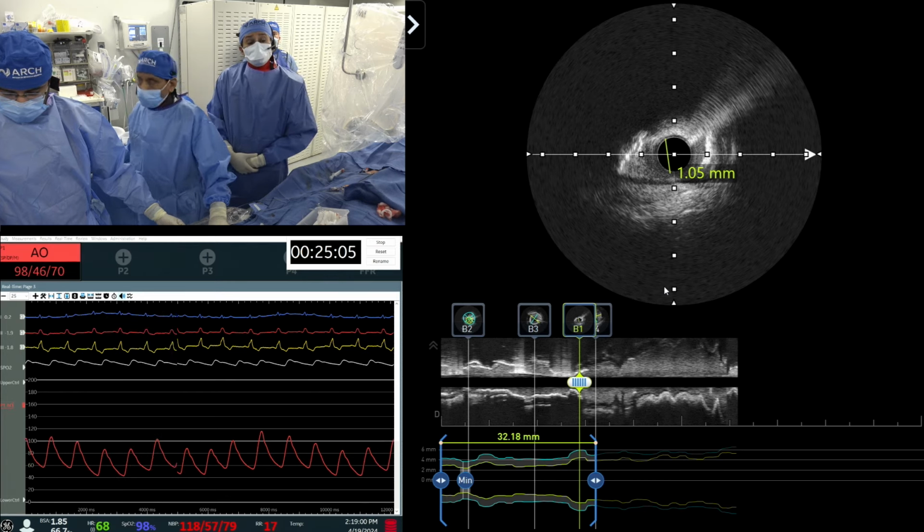Absolutely correct statement. I have a different view. If the IVUS catheter did not pass, but at the level where the IVUS was, it was not because it was a tight lesion. The lumen was okay. So I think the 1.75 burr was needed for the calcific nodule. And further down, there is no disease actually. Only at the level of the diagonal, we got a 3.0. I think we needed the 1.75 burr. Actually, I think it got stuck in that calcium that's distal, where you were having problems.